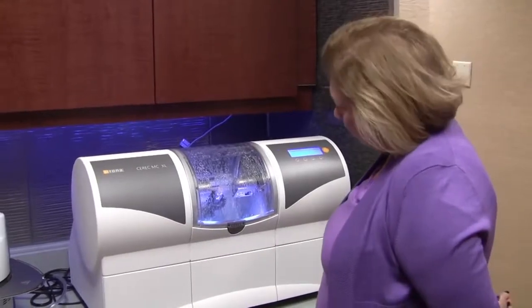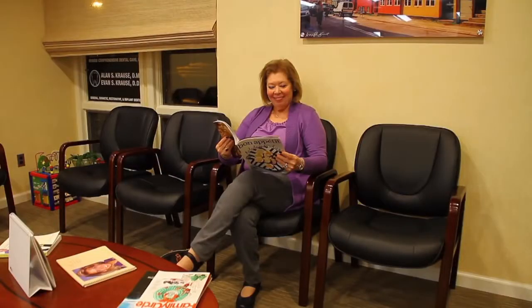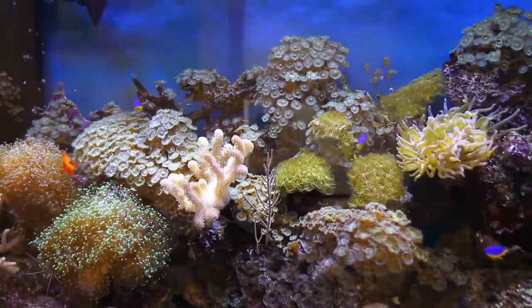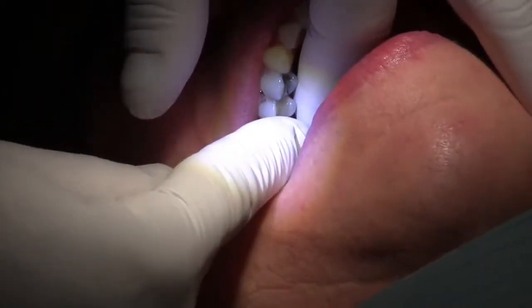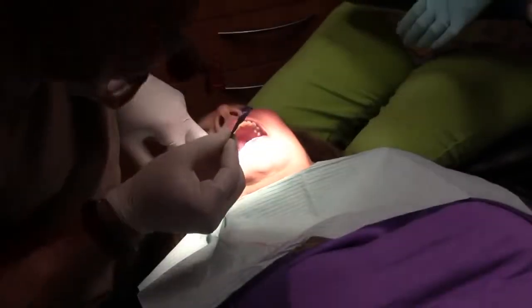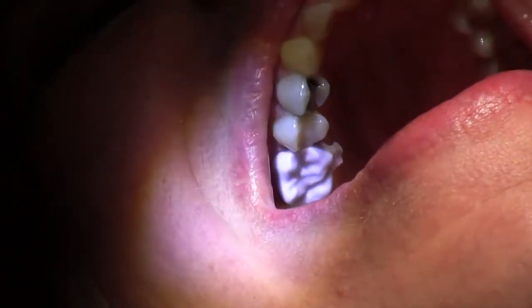While most patients enjoy watching their crown being milled, patients also have approximately 10 minutes to relax in the operatory or waiting room where they can watch TV, read a magazine, enjoy our saltwater fish tank, do work, or play games on our iPad. After the crown is milled, it is placed in the ultrasonic cleaner to remove the lubricant and is tried into the patient's mouth. At this point, the bite and the contacts in between the teeth are adjusted and the anatomy is further defined.